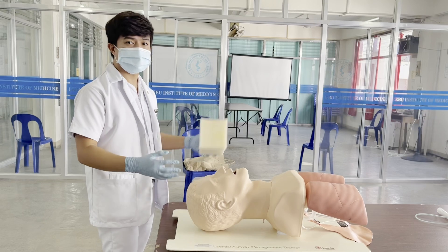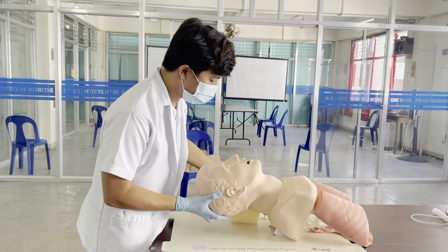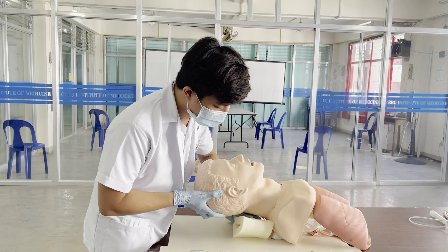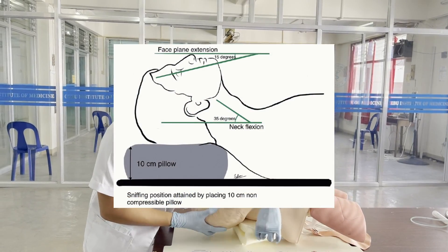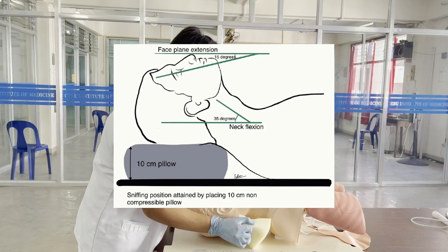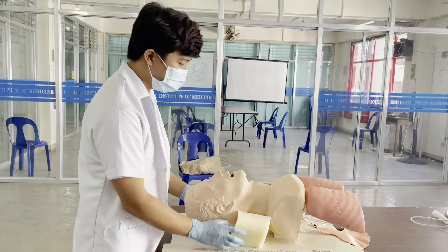Basic airway. Position the patient in a sniffing position by placing a pillow under the patient's head. A combination of neck flexion and head extension is considered to be suitable for endotracheal intubation.